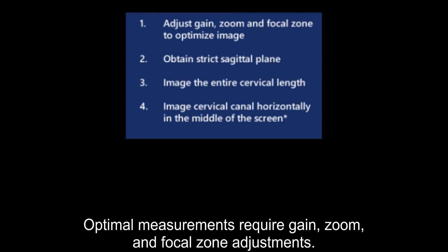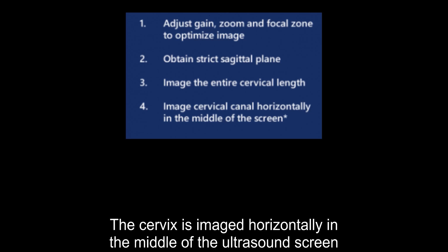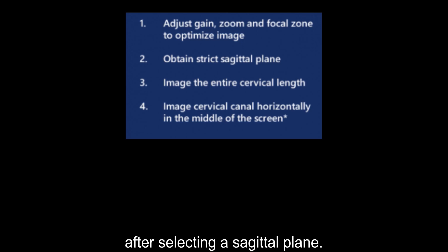Optimal measurements require gain, zoom, and focal zone adjustments. The cervix is imaged horizontally in the middle of the ultrasound screen after selecting a sagittal plane.